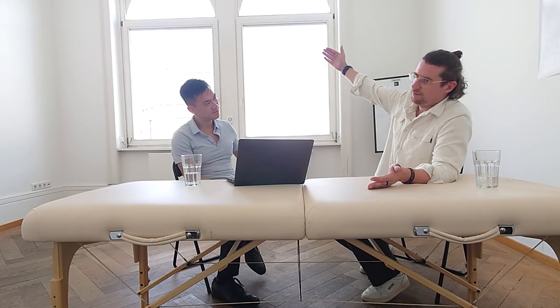And then I can do the mapping, and then I can really clearly say I want to have more than, let's say, 250 microvolts. Always knowing that the subcutaneous fat is an issue. If you have too much fat, then you can't say that, alright? Then it's always less. But for normal people, roundabout, you can go in this direction. So we have a big range from lower than 50 microvolts up to the highest we have measured, which was like 1800 in the gluteus medius. So in this range we definitely see over like 50,000 measurements.